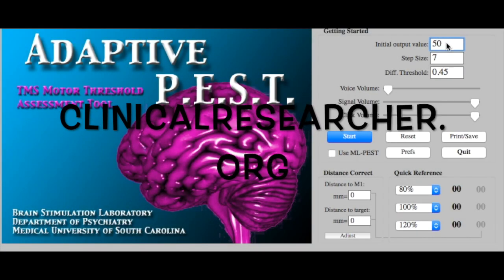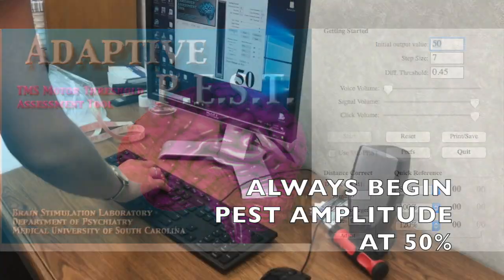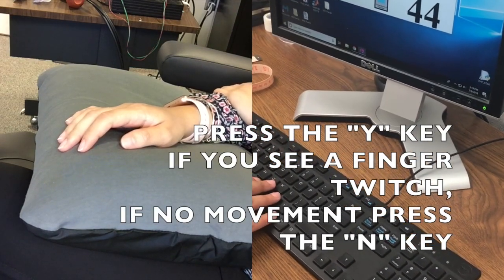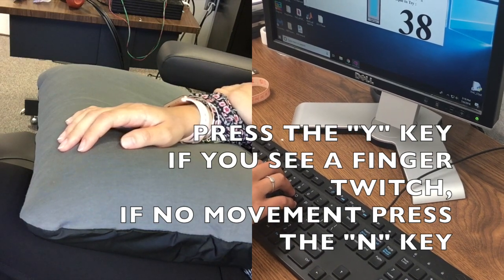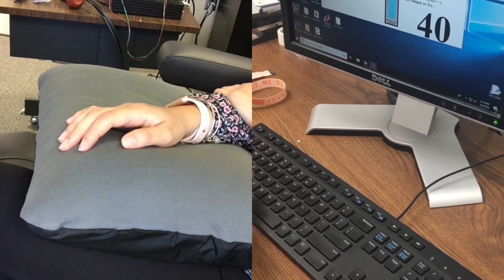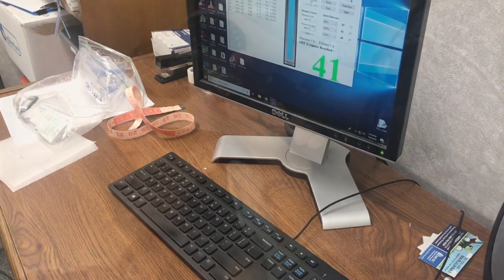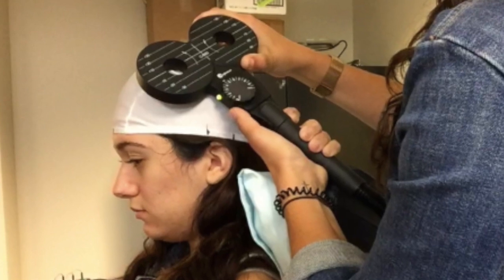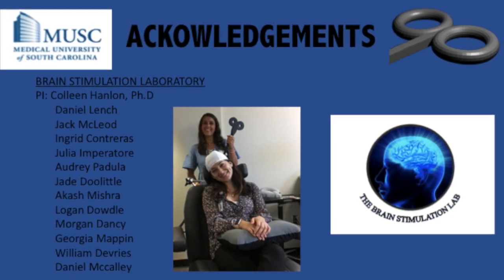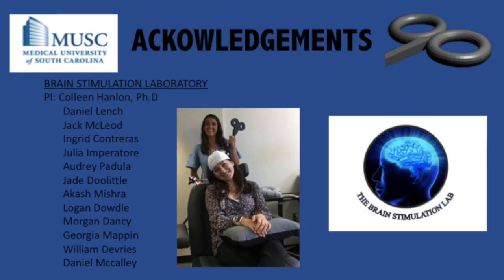To start, you can go to clinicalresearcher.org to find the adaptive PEST system. This program will help you find the right dose. You always want to begin the amplitude at about 50%. When you see the participant's finger twitch, press the Y key. If you see no movement, press the N key. The program will adjust the amplitude based on your input. The amplitude will turn green when the system has found the correct dose. Once you've found the correct dose, you're all done finding the resting motor threshold.